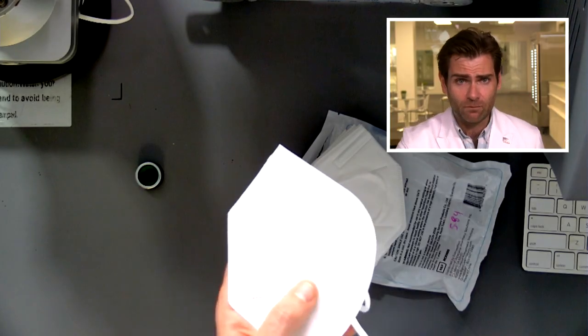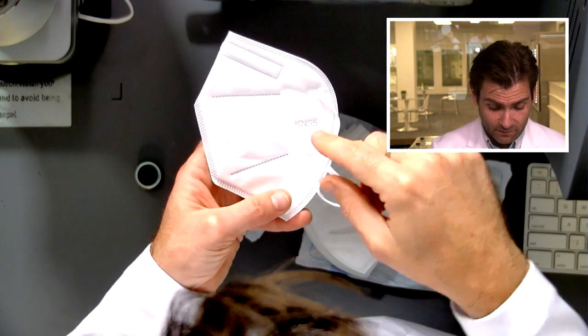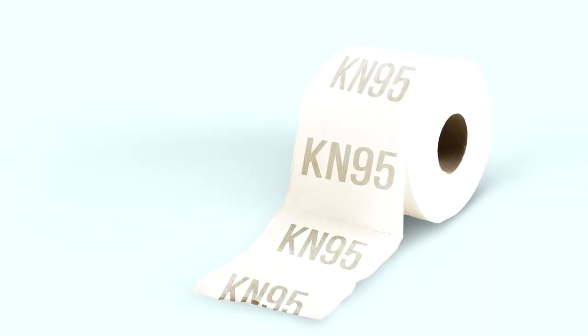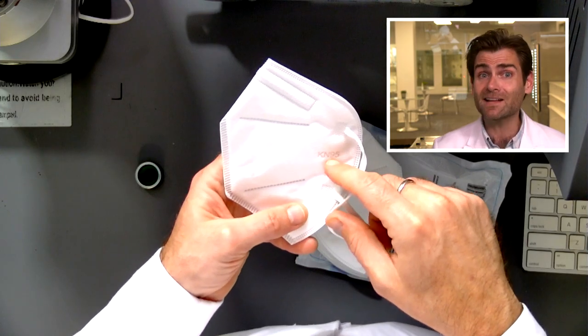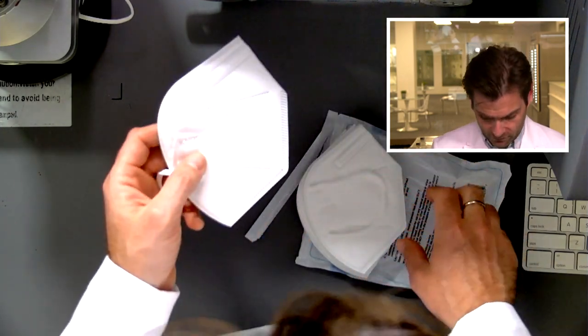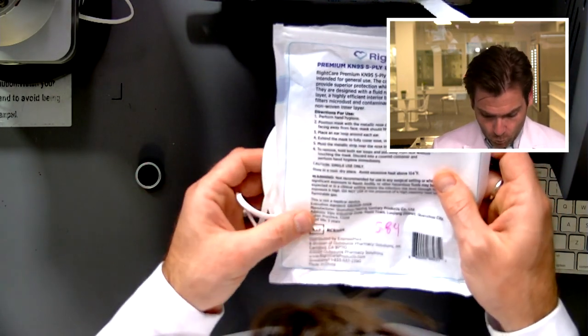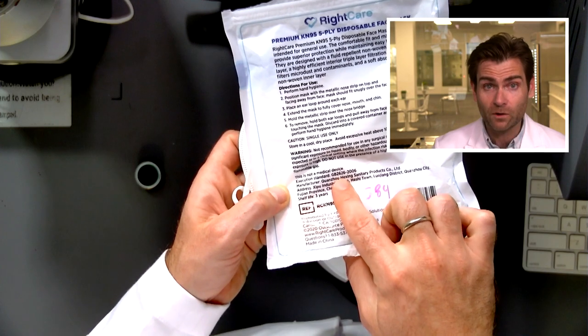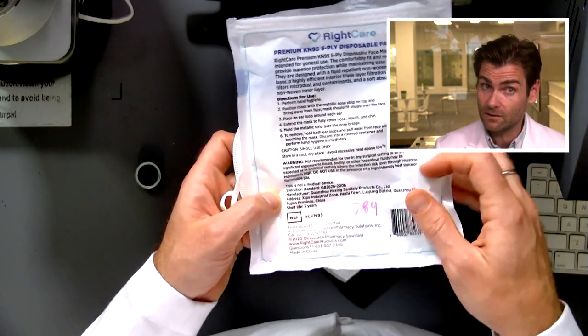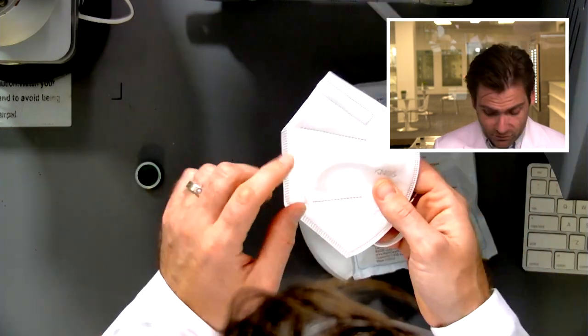It also works for the KN95 test — basically the same test. How can I tell this is not a KN95? Well, it says KN95 on it, but you can't just take a piece of toilet paper, stamp KN95, make it a mask — that's not how it works. There's science involved, standards. Part of the standard is writing a couple of things on here. What this is missing is which KN95 standard. This one on the back is GB 2626-2006 — that needs to be written on the mask.